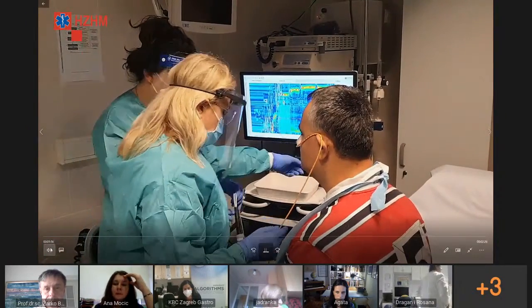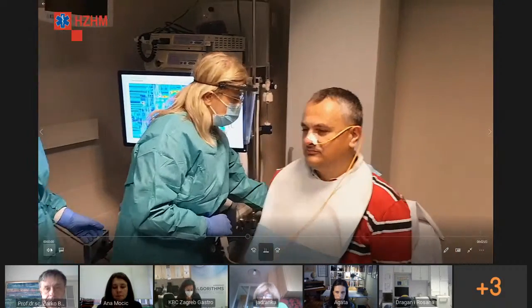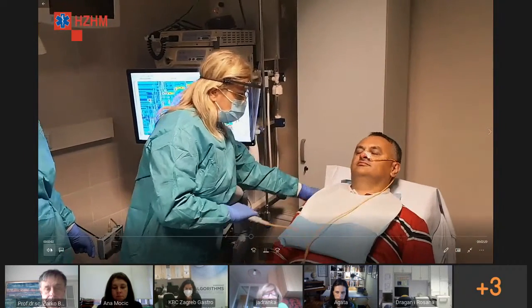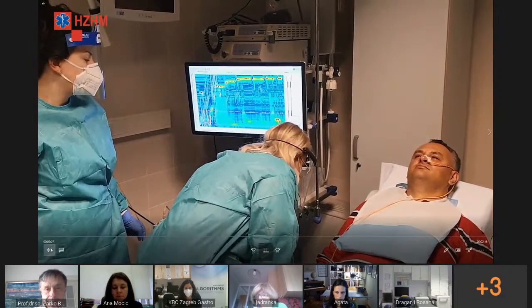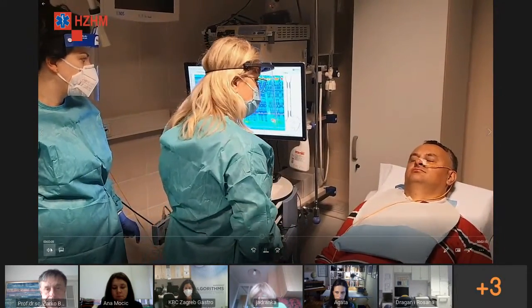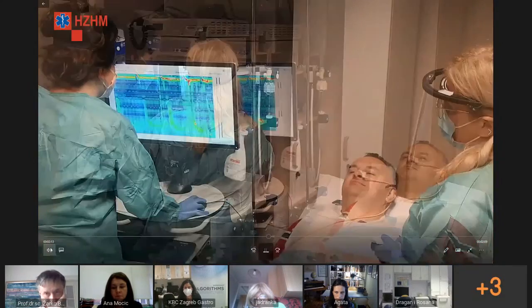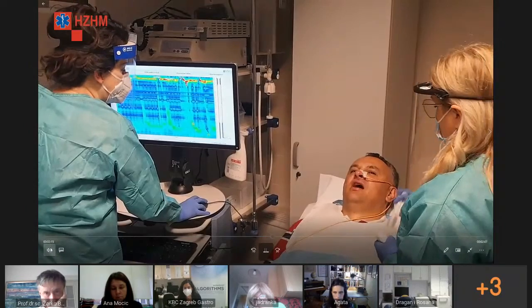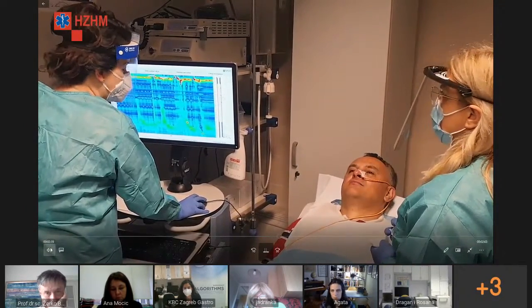Ovako možete leći na krevet. I idućih 3 minute nećemo razgovarati s vama. Nelagoda koju osjećate je normalna i prisutna. Ajde, dajte nam slobodno. Ajmo gutati.